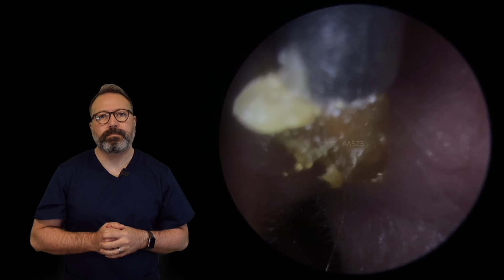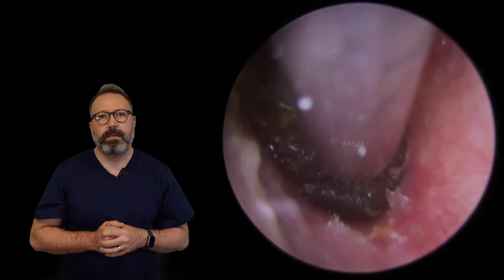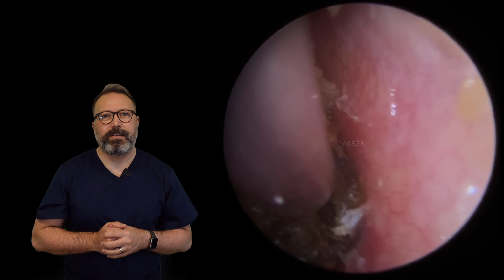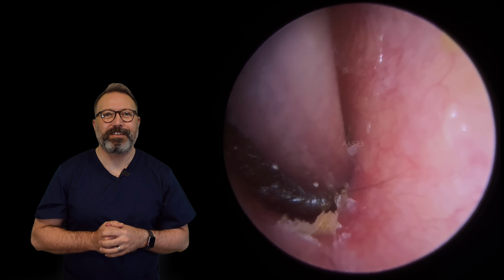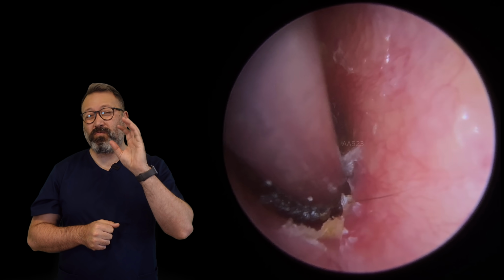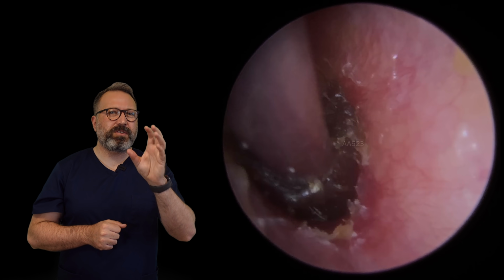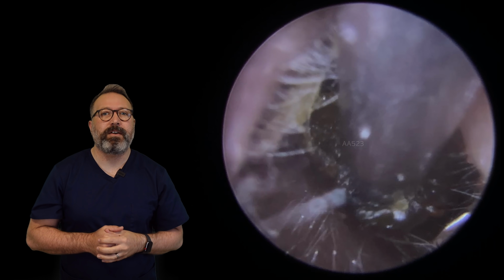Here we are. Lift it nearly. Let's get it. Oh, it's so packed down in there. Such a tough one to do. We did a really tough one, I think it was probably about a week and a half ago now, where it was a sort of impacted skin husk. Oh my goodness, that was a tough one. But this has started to come away now really, really well.